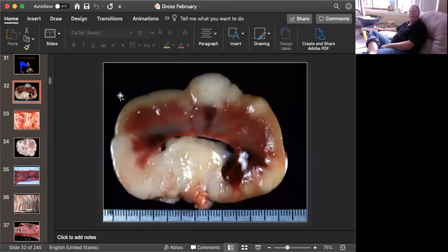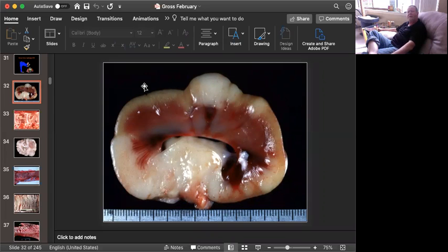Slide number one is tissue from a cat. All I'm asking you for is a morphologic diagnosis and a cause.